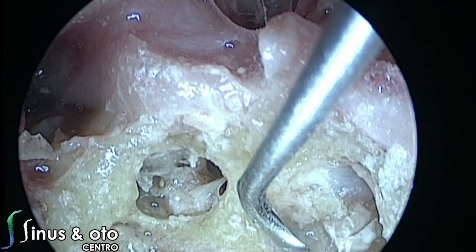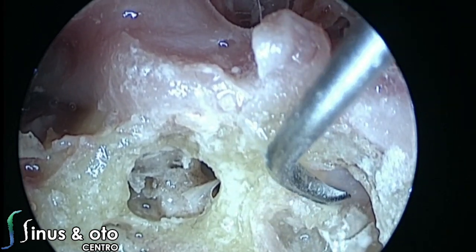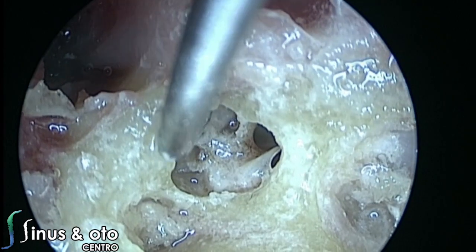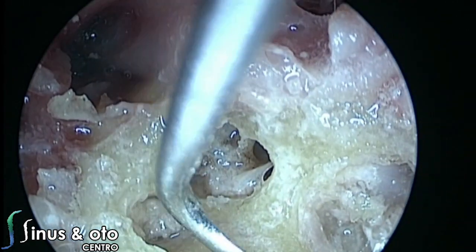So we have the spherical recess, the elliptical recess over there, the vestibular crest between the two, the endolymphatic sac over there, and the facial nerve is there. This is the modiolus and the region of the scala tympani and scala vestibuli of the middle turn, and the apical turn of the cochlea above over there.